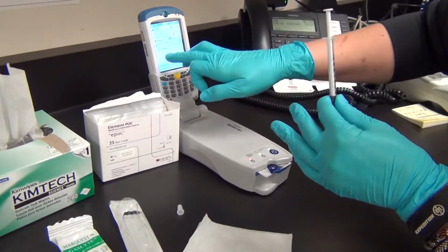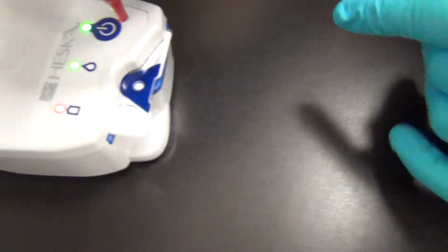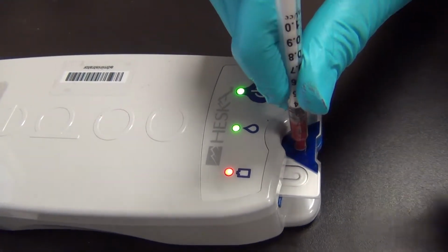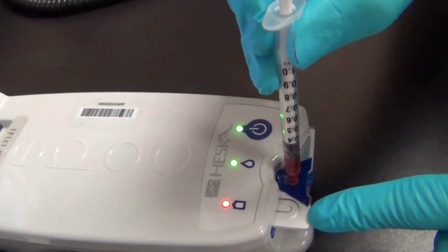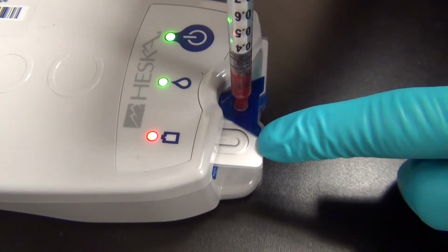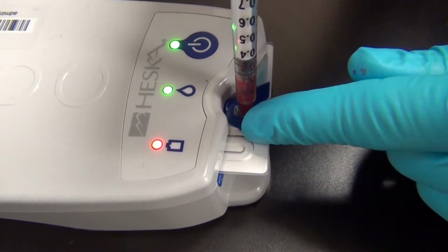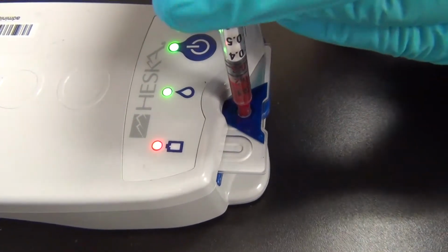My analyzer is now displaying inject sample. So I'm ready, it had beeped and I'm ready to put my sample in. We're going to add the sample to the blue well. You lock your syringe in straight up and down and twist a little to get a firm up and down setting, and then you're going to depress the plunger. While I do that, I'm going to have you focus on this U. There's going to be an air bubble that shows up here, and immediately after the air bubble is showing up, there will be a beep. We want to rely on the air bubble being shown at the bottom of the U or a little past as far as how much sample to add. It should be time-wise calibrated to about the beep.